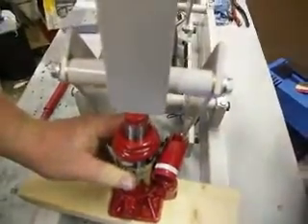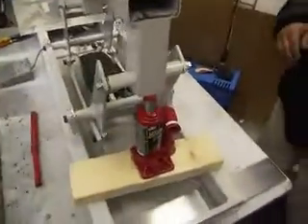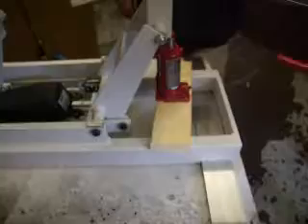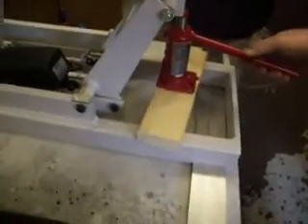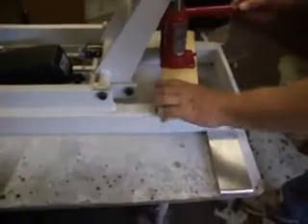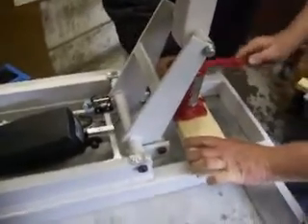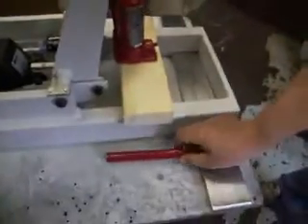All right, now we're in a safe working condition at this point. The table is blocked up. The floor jack is in place. The relief valve has already been closed. And we can now raise the table to the highest position. Okay. Very good.